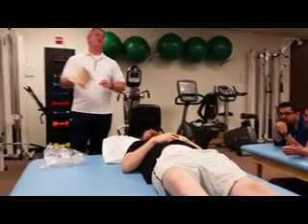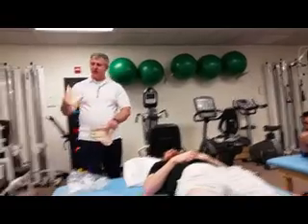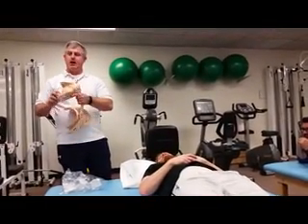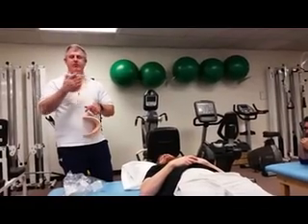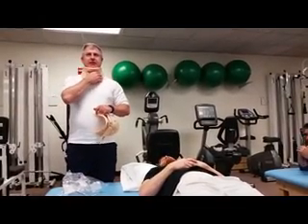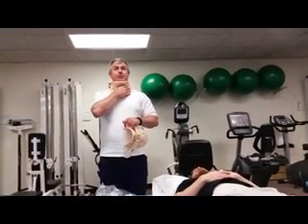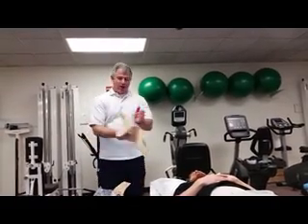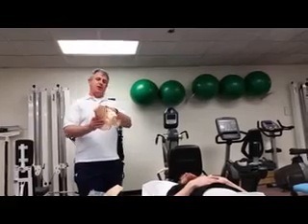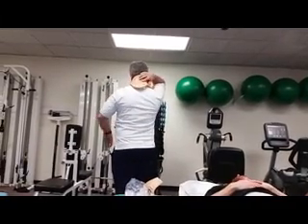So this is a Philadelphia collar. There are all different kinds of collars. Philadelphia is the name of this one. If you notice, there's a hole for the trachea, and a little pad here for the chin to rest on. I want to make sure that once I get it on, the chin is resting in there. I don't want it too tight where they can't move their chin a little bit or can't breathe, so I need to communicate. On the back side, this part is going to go below the earlobes, and I'll show you in just a second. This back part has to go down the upper traps and down the spine.